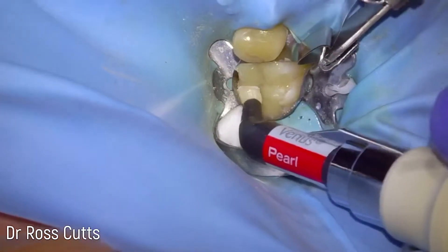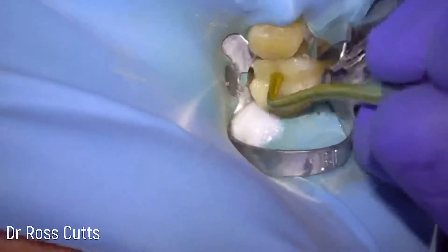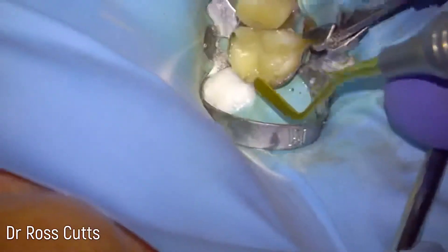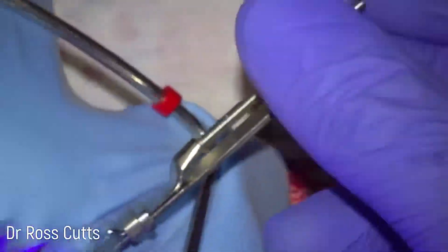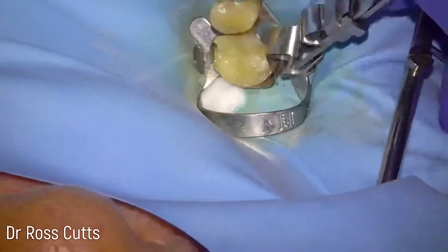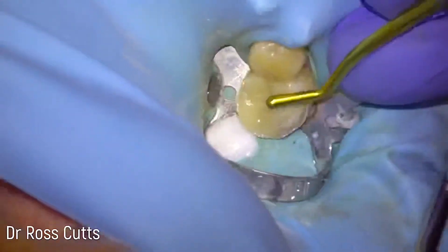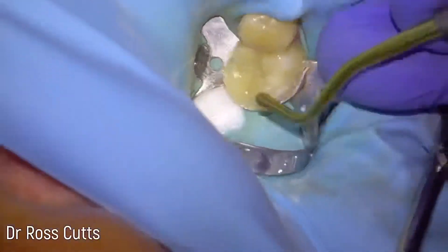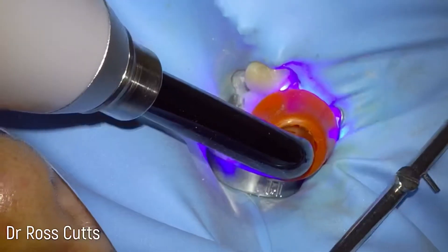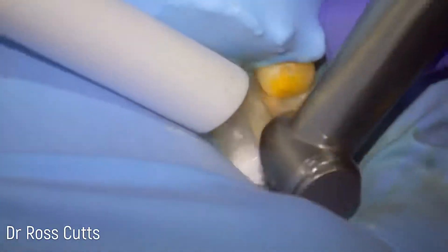Then the distolingual cusp — always the most difficult cusp. We fill in any little areas where it's not fully packed with composite resin material, and our tooth is starting to take shape.